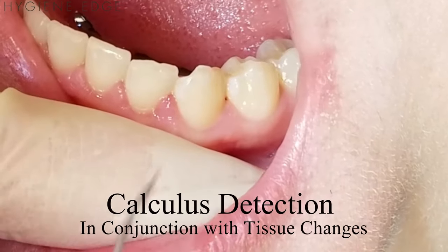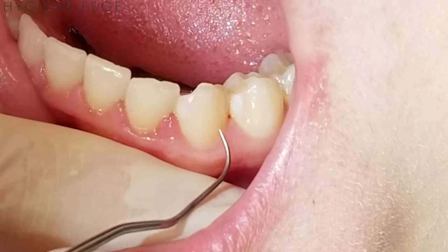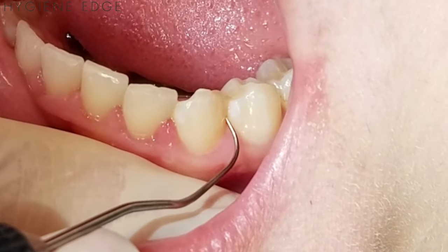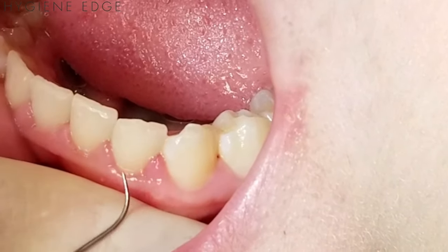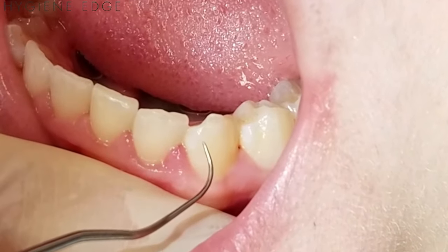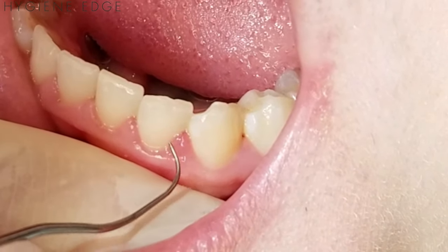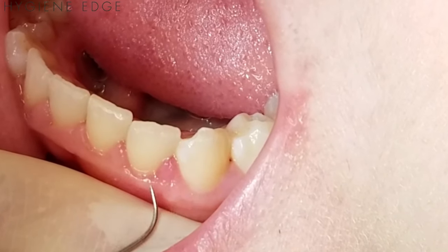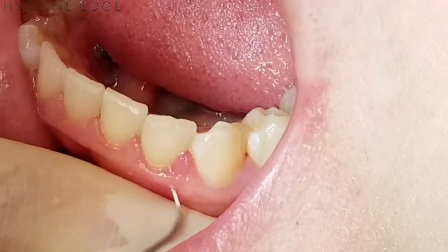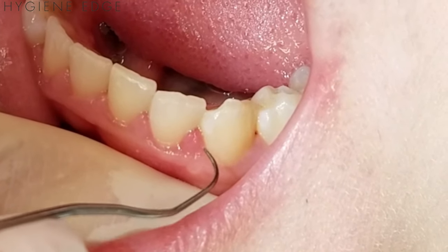Notice the difference between this interdental papilla here — knife edge, tight against the tooth, light pink — and this papilla here between 22 and 23. It has an erythematic margin, a little bulbous and more erythematic in coloring as well. This is an indication to me that something is stuck underneath that gingiva.